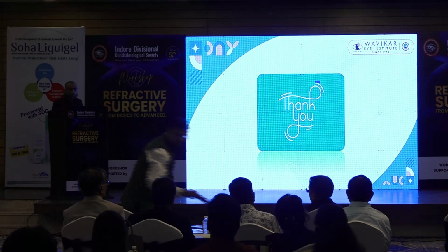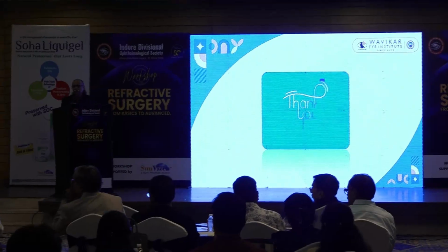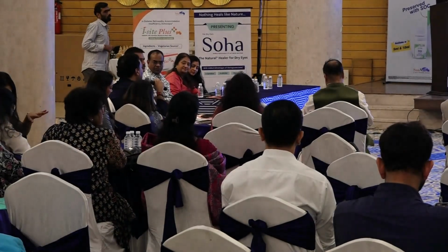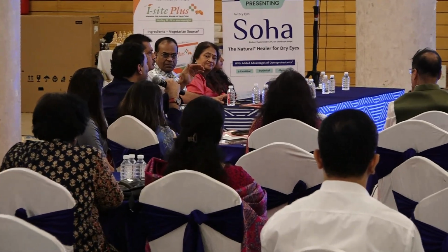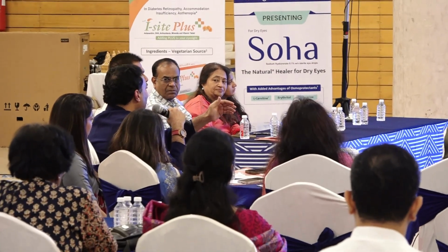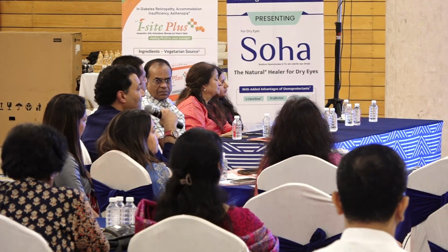I think, the world over, one interesting thing is exactly what you showed: the gain of lines is more in this, because it is looking at remodeling every layer of your cornea, maybe because of that. So I think that is what is seen in your studies and also everywhere else.